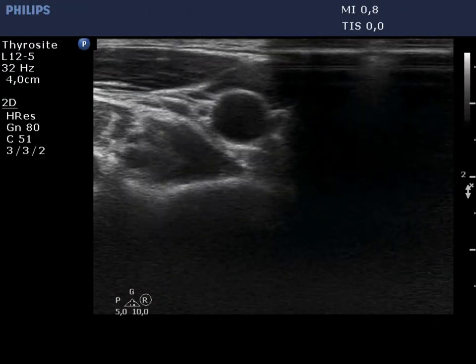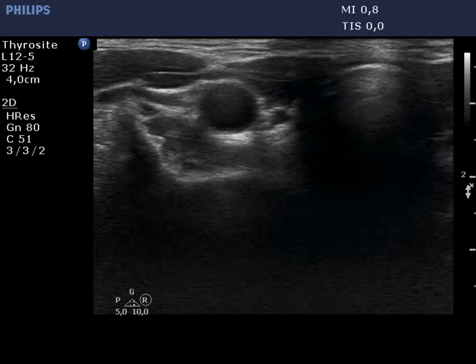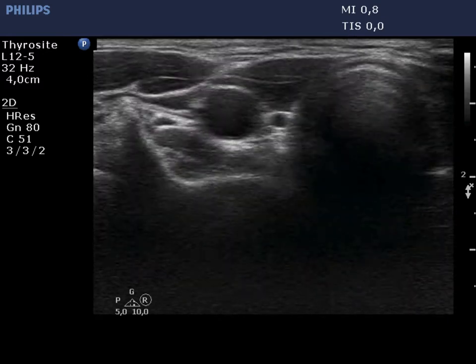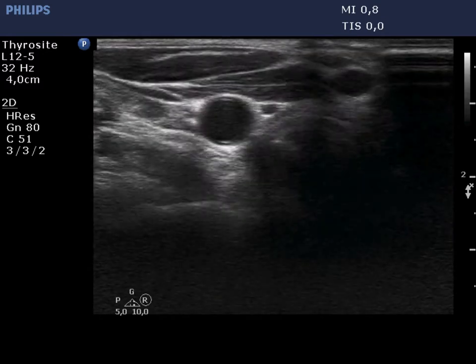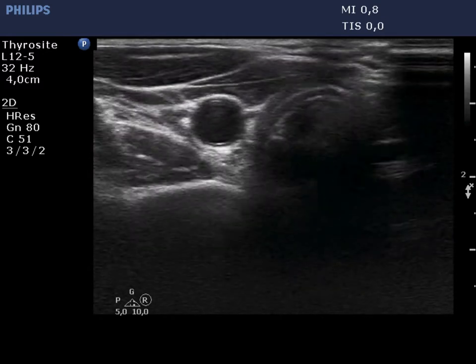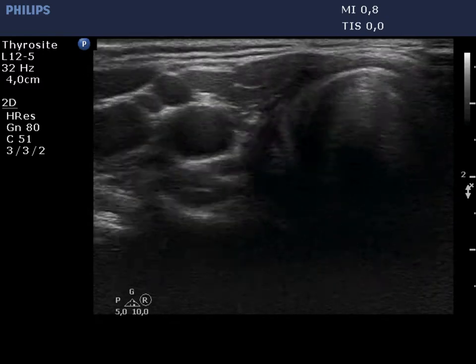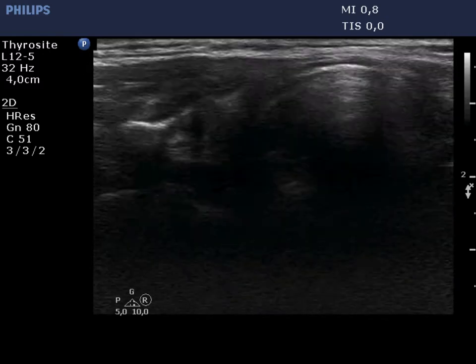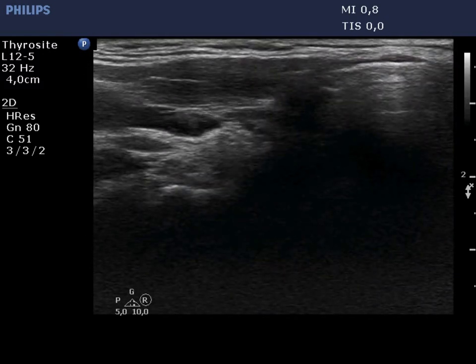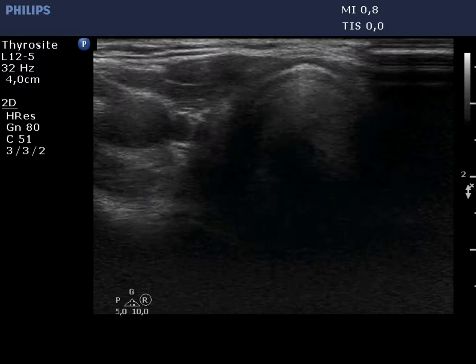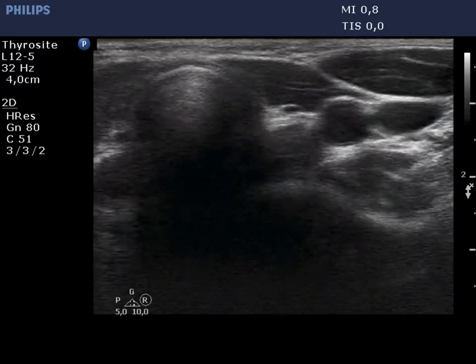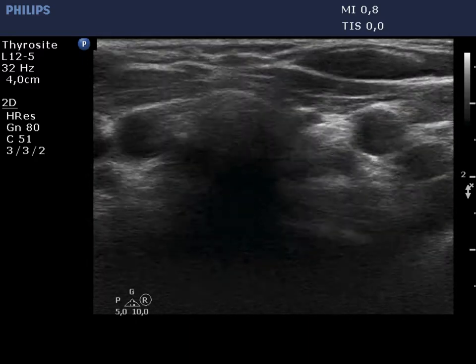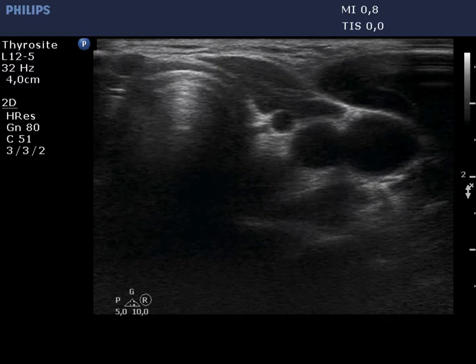First, we present the right thyroid bed. We have found no normal thyroid. Connective tissue and muscle fiber replace the normal thyroid gland. The situation is similar in the left thyroid bed. This presentation is the same as that after a total thyroidectomy.